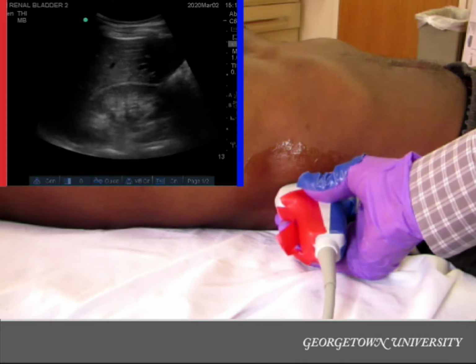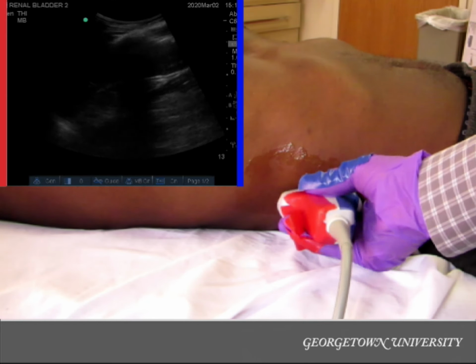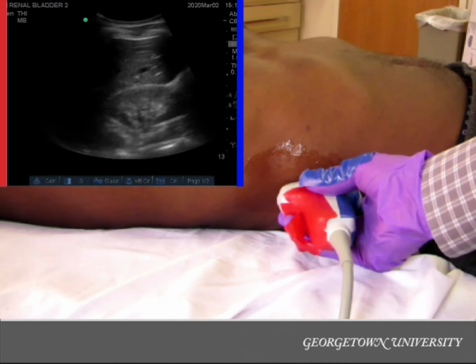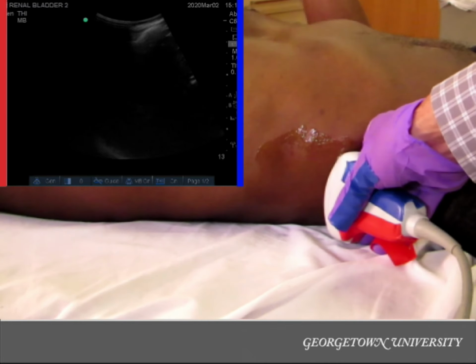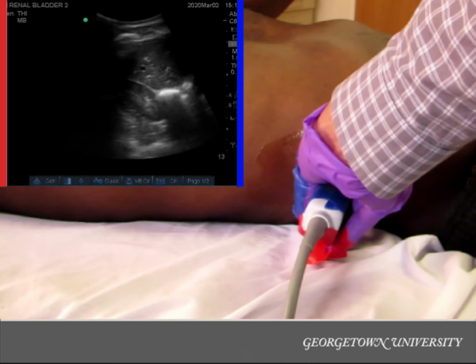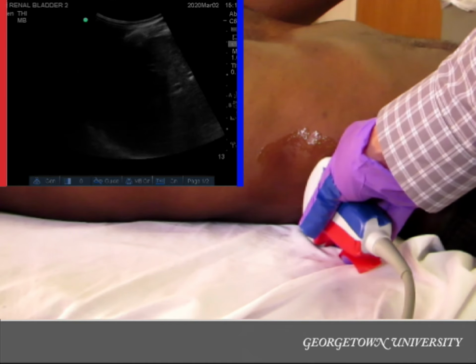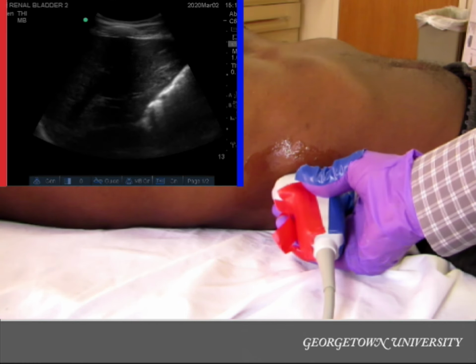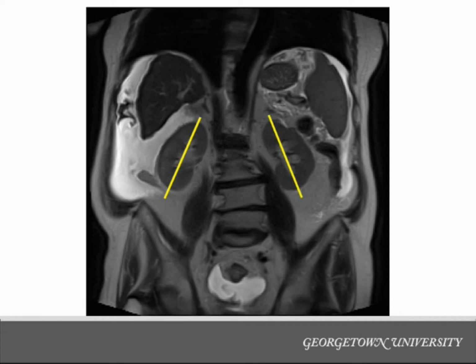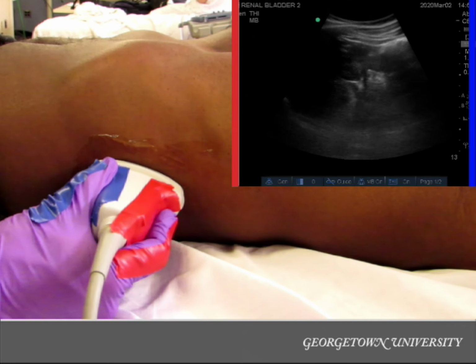Once you've measured the long axis of the kidney, sweep through it by tilting anteriorly and posteriorly to evaluate its full extent. Then you can find the short axis of the kidney by rotating further posteriorly and sweep superiorly to inferiorly. Remember, any abnormalities should be seen and evaluated in multiple planes. Finding the left kidney is similar, though is often slightly more superior, and when using the spleen as an acoustic window, it is more posterior.